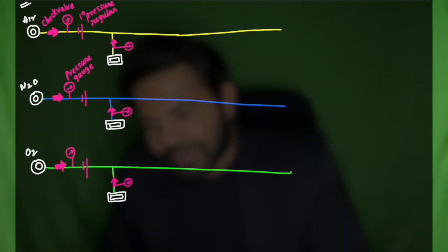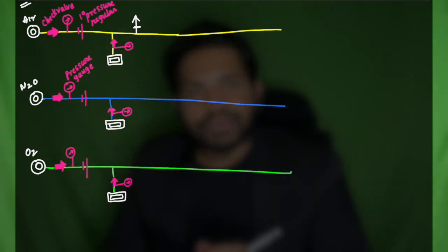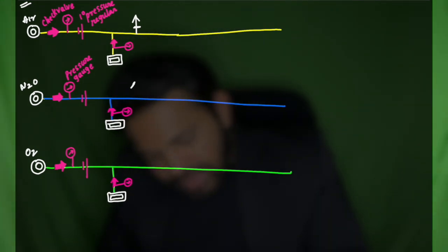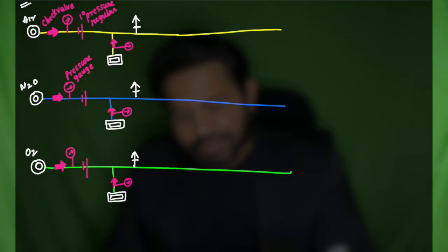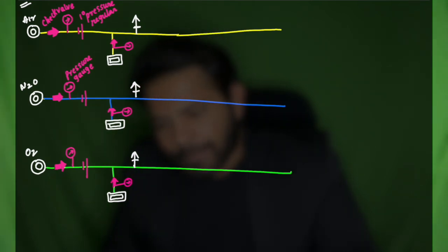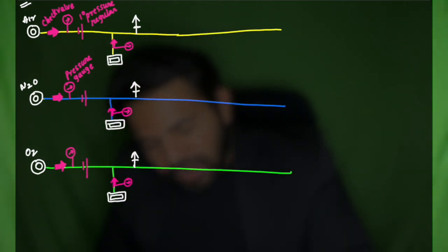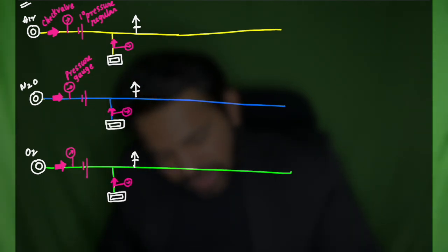Then we have a pressure relief valve. We have come from high pressure to the intermediate pressure system. So there is a pressure relief valve for all the gases. You remember the parts still here. Then moving on, when you come to the oxygen supply, here you have an attachment of the power outlet.